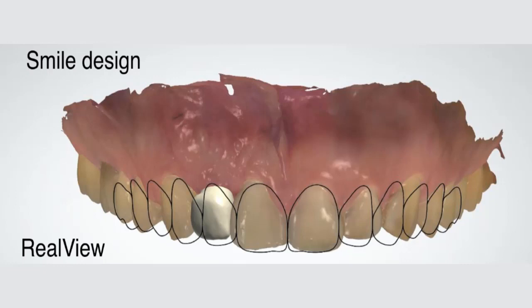As I always teach people, my belief is if you want to really develop the whole design concept, you should have 3 steps. First step, I would call motivational buy-in. What is motivational buy-in? The patient comes, the patient would like to change that restoration. Of course, in this case, as you can see in the scan, I could change other things for the patient, but he was just looking for this change in restoration.